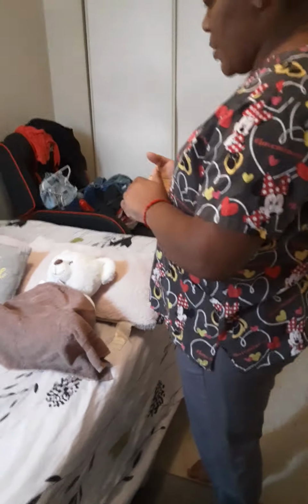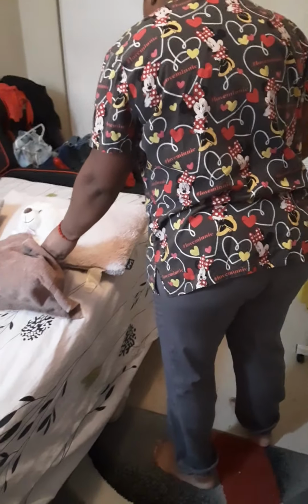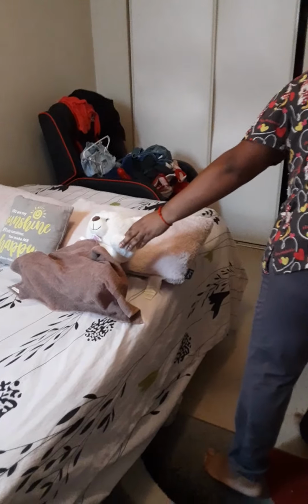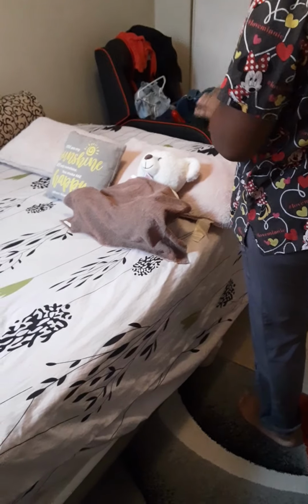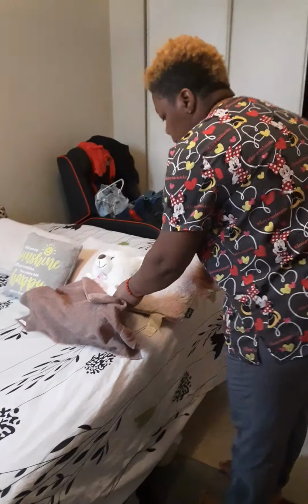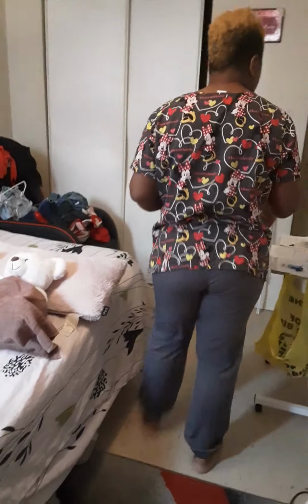Hi, my name is Melissa. I'm going to be your nurse for today. Can you confirm your name and date of birth, please? Okay. I will also check the information that the patient has given me with my MAR and my doctor's order, to make sure I'm seeing the right patient. Mr. PNL, date of birth. Okay, Mr. PNL, do you have any allergies? No, he doesn't have any allergies. I'm going to also assess the site where I'm going to give the medication. The skin is intact, so I'm going to go back and start to prepare my secondary line.